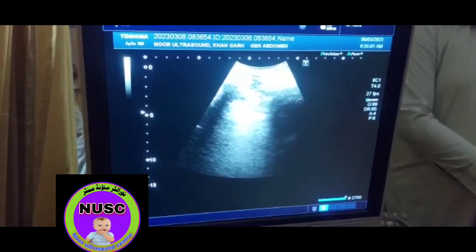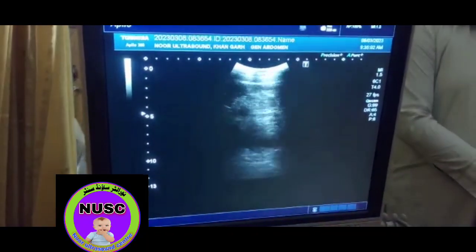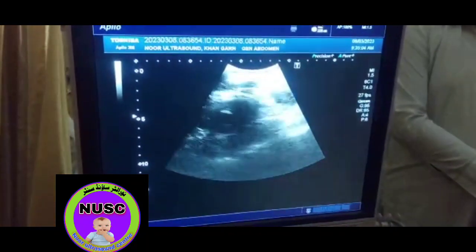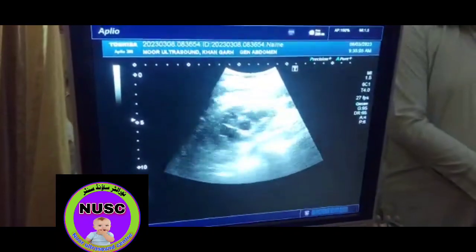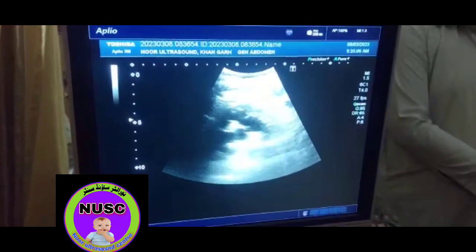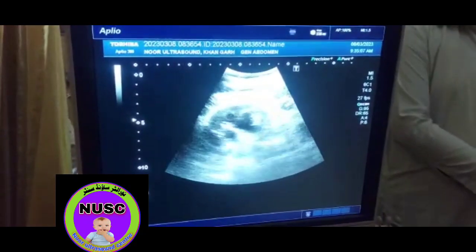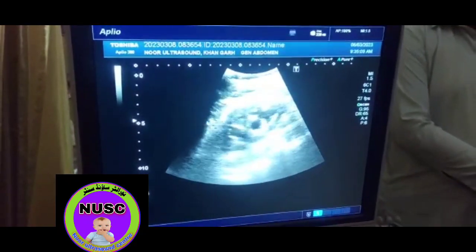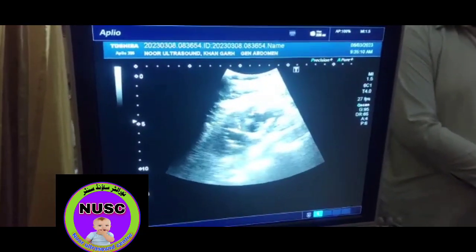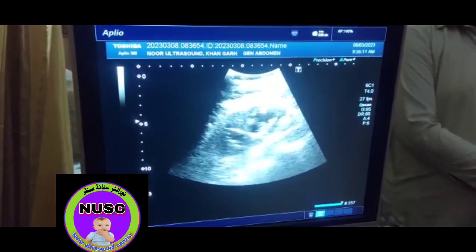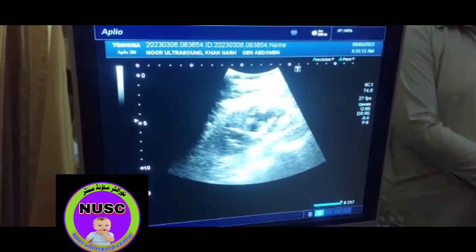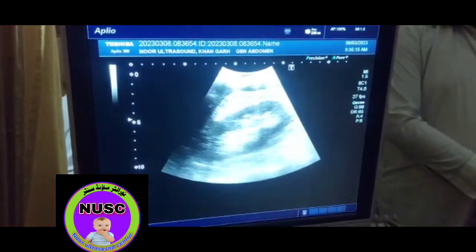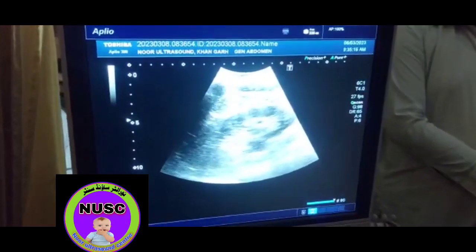Now we see on the left side, the kidney reveals moderate hydronephrosis. This is the left kidney, and this is the right kidney, which is normal-looking.